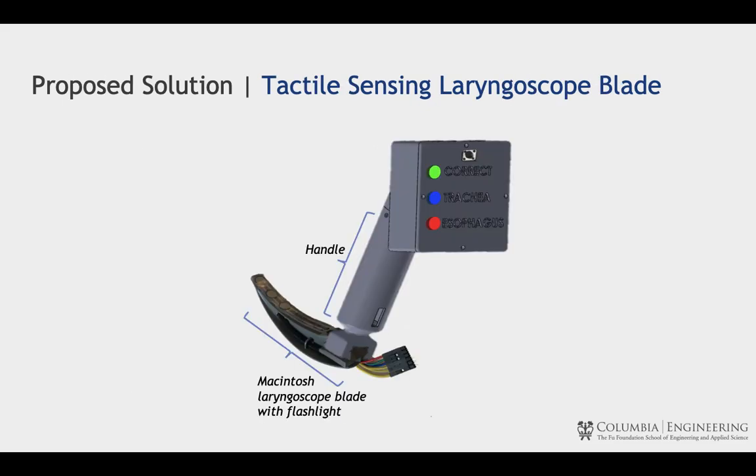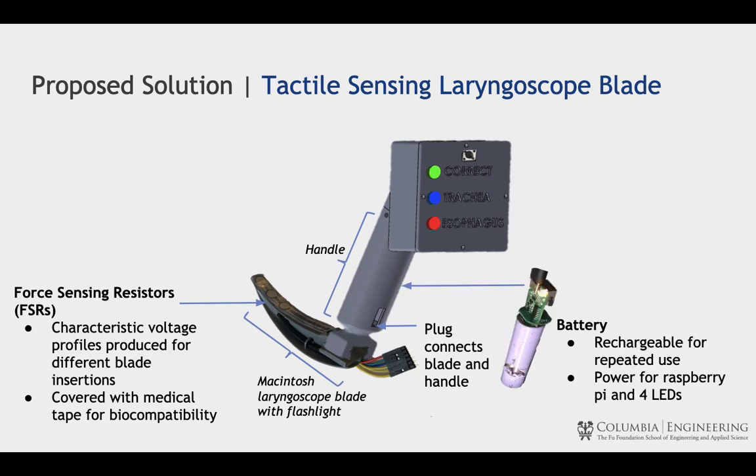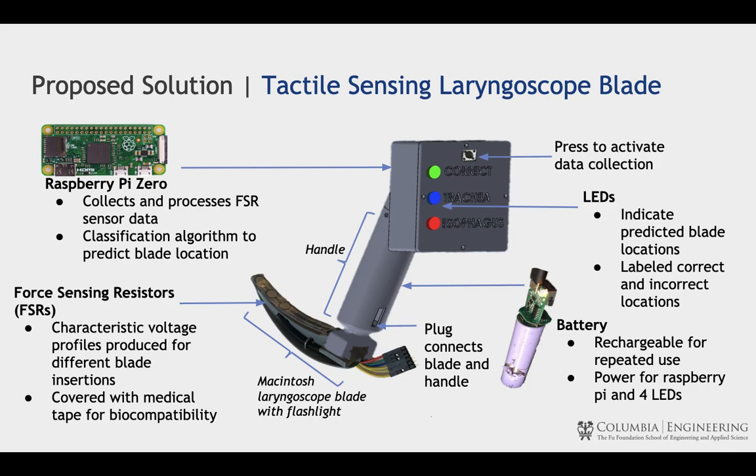Our solution is based on the Macintosh laryngoscope. We devised a touch-based solution where we place three force sensors at the top of the blade. Pressure data is transmitted through wires that plug into the handle, making the handle reusable and the blade disposable. Components are powered with a rechargeable battery, and a Raspberry Pi Zero processes collected data and outputs whether the intubation was successful or not. This result is then displayed by LEDs.